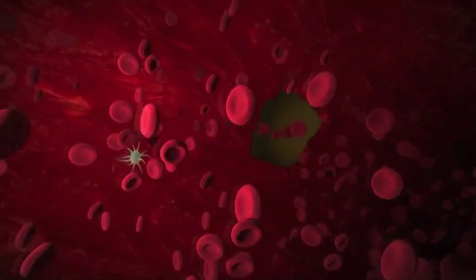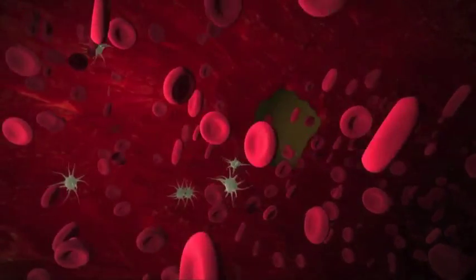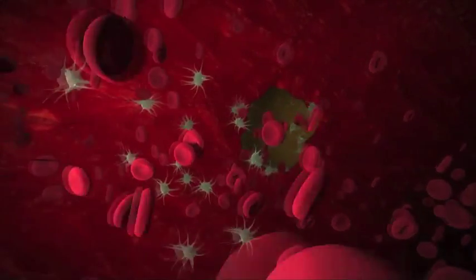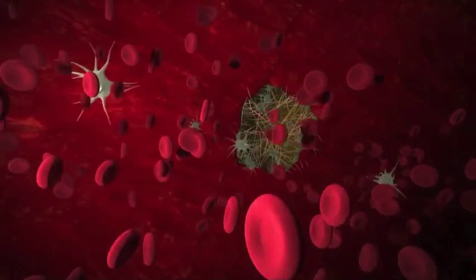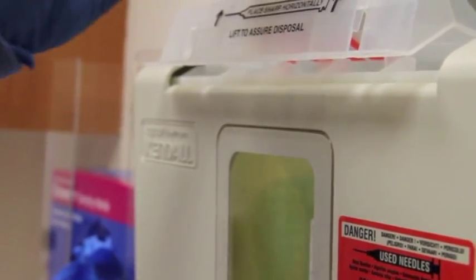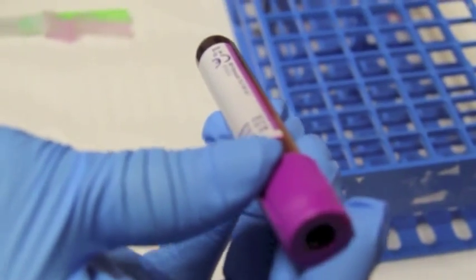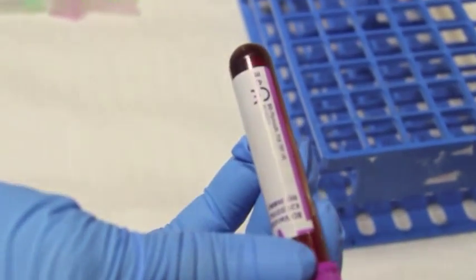Pressure on the puncture site causes the platelets to immediately aggregate at the puncture site, forming a plug to ensure the formation of a fibrin clot, which will prevent a hematoma forming. The used needle is immediately disposed of in the sharps container. The tube of blood is gently mixed to activate the anticoagulant or additive.